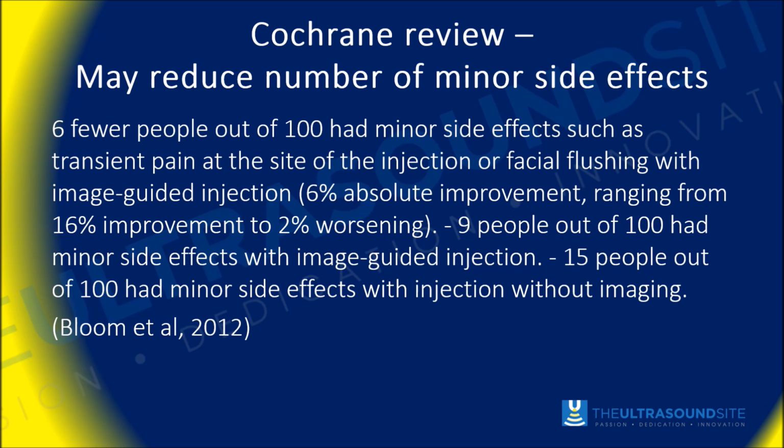The Cochrane review also found that there were fewer minor side effects in patients having injections for subacromial subdeltoid bursa in the patient group that had ultrasound guided versus surface mark guided. So 15% of the surface mark guided had minor side effects versus 9% of the ultrasound guided injections. So again, there may well be some additional safety benefits from doing ultrasound guided injections.